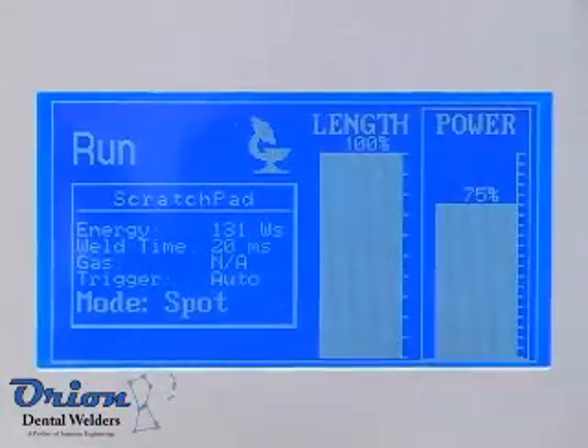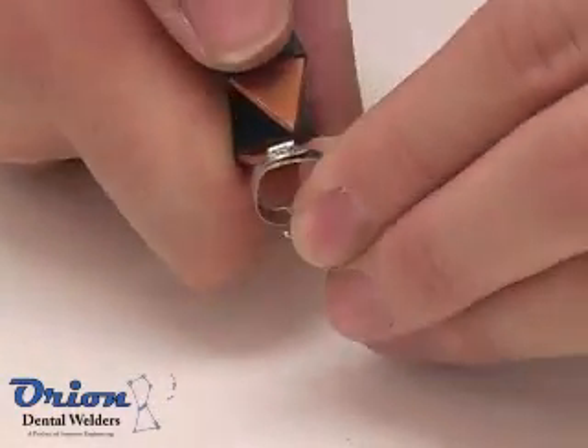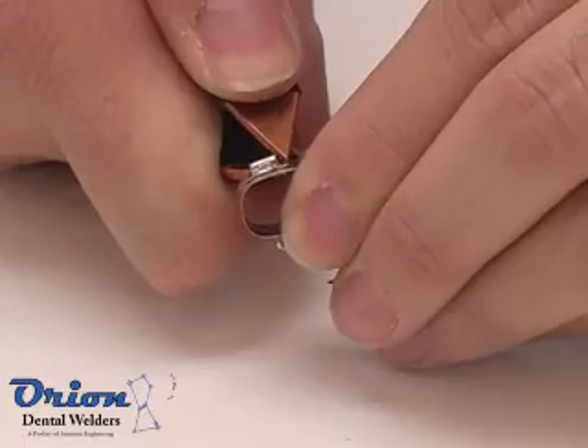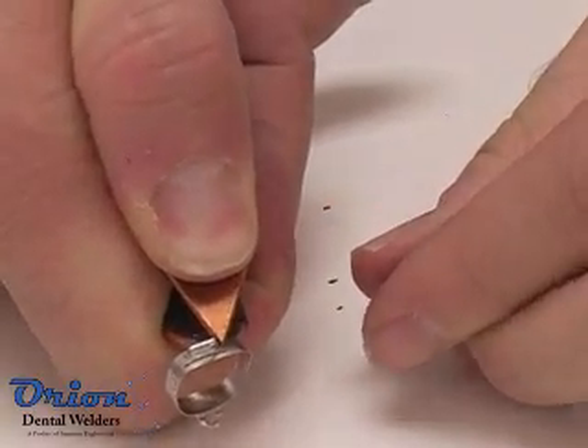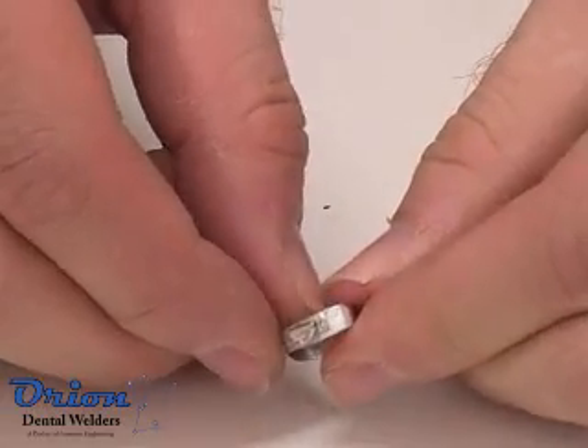Resistance or spot weld mode allows you to use the Orion as a high power capacitive discharge spot welder. The spot welding mode can accept up to 10 AWG cabling and provides from 3 watt seconds to 175 watt seconds of weld energy.